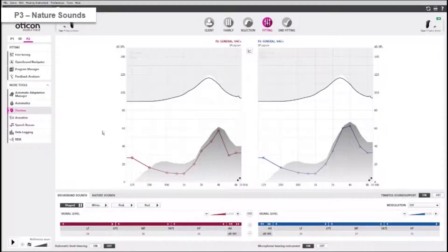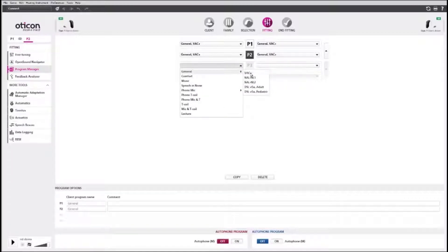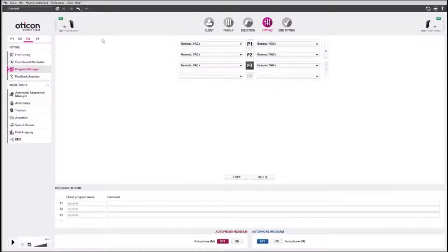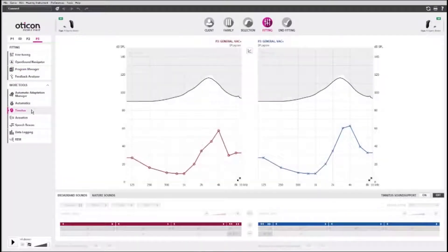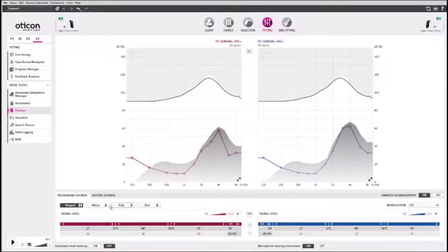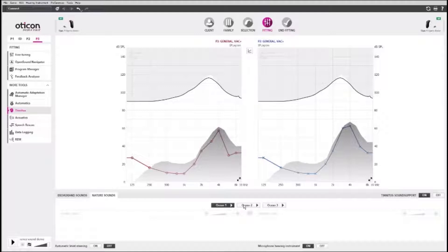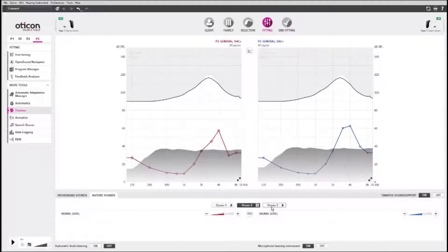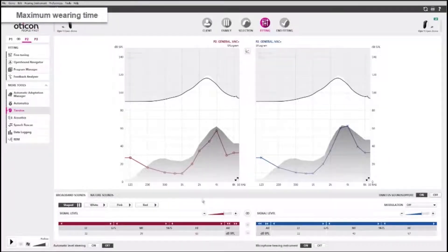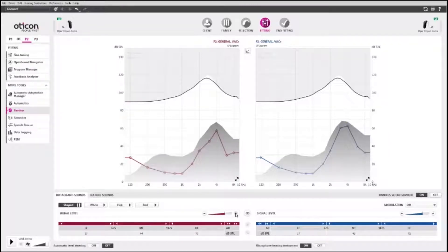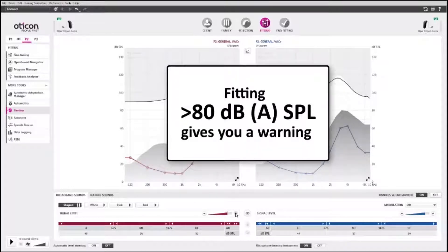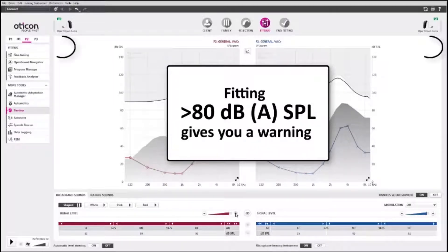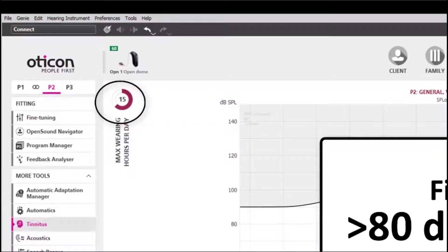You may want to set nature sounds in P3 to be a soothing alternative to the broadband sounds in P2. When you select nature sounds, you can choose between three types of ocean sounds. Be aware that the tinnitus sounds can create high-level outputs. If you fit hearing aids over 80 dB, you will get a warning and should instruct the client on maximum wearing time.